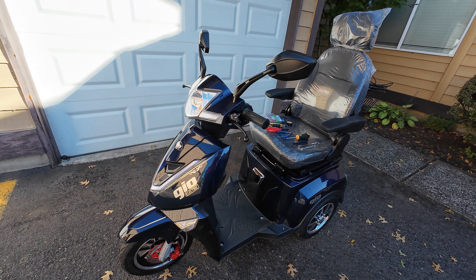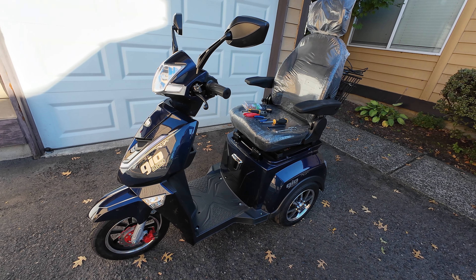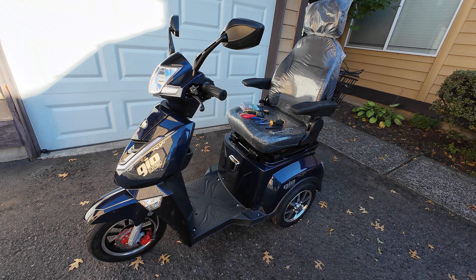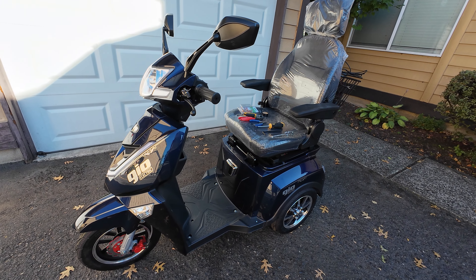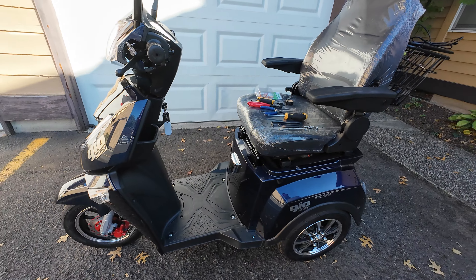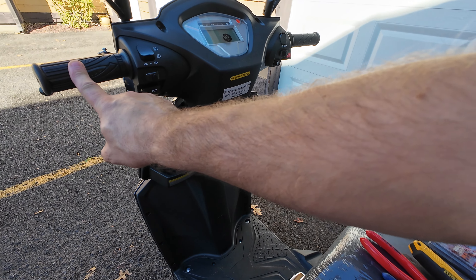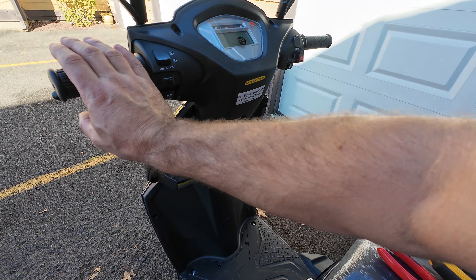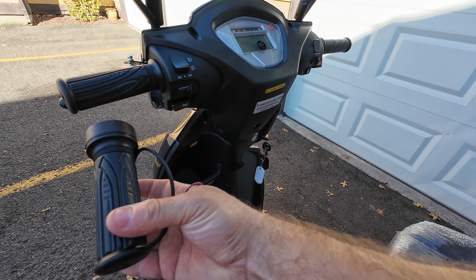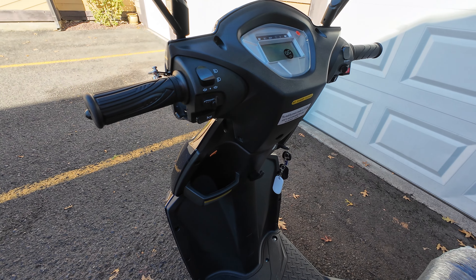Hello guys, so today we have a GeoTitan mobility scooter — it's a premium model. If you don't know whether your scooter is premium or a regular GeoTitan, please look at my other video where I'm covering the difference between those two in a five to six minute video. This is a 2023 model manufactured in September.